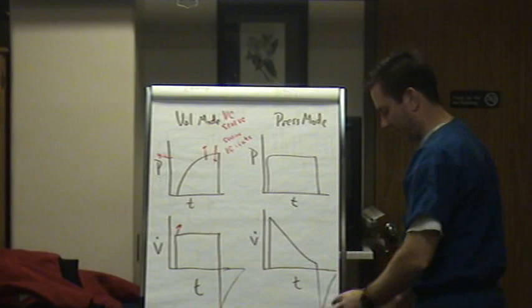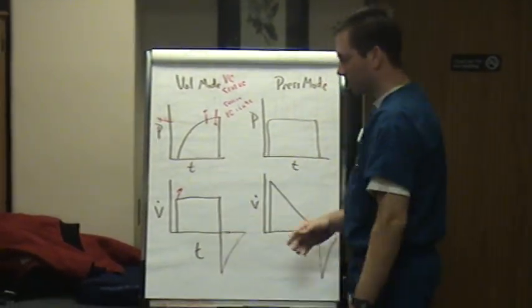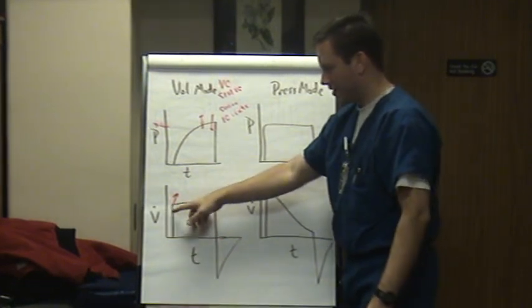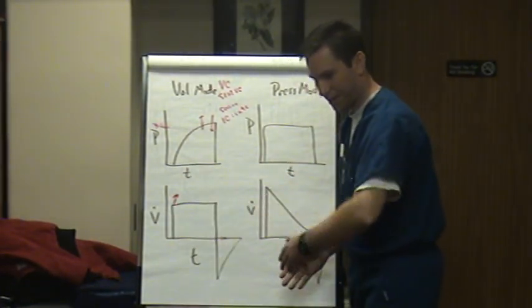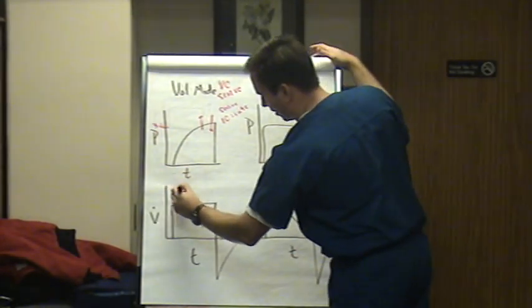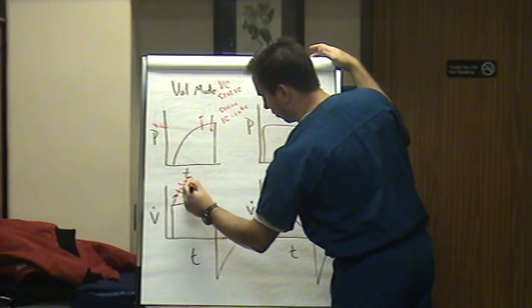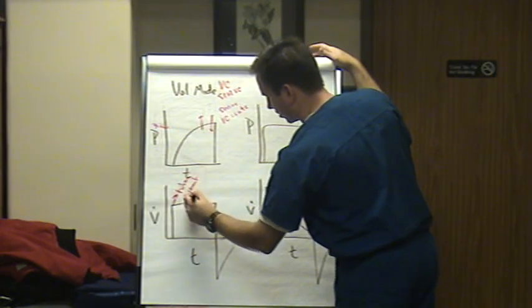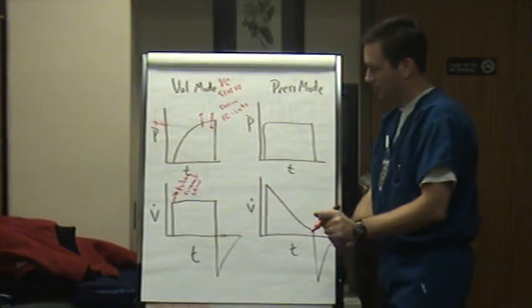Flow is released from the ventilator. If I had a ventilator sitting right here, I had the tubing, and it goes to the patient, as soon as the breath is delivered, what's the first thing the flow has to fill before it even reaches the patient? What's between the vent and the patient has to fill up first? The tubing, good. So it fills up the tubing first, and I'm going to write circuit, and LAW for large airways. So that's the first thing it fills when it leaves the ventilator.